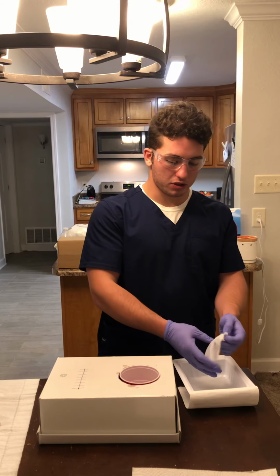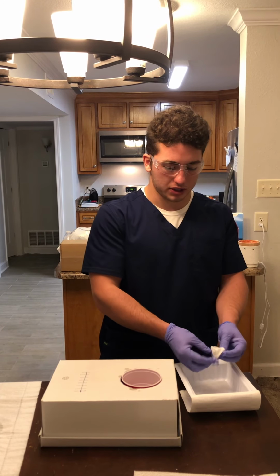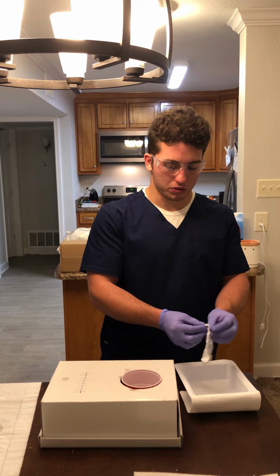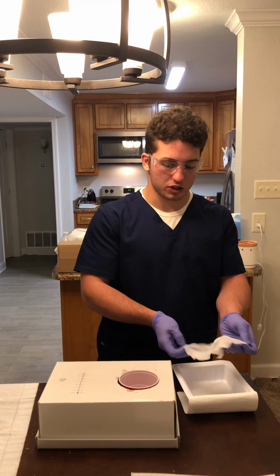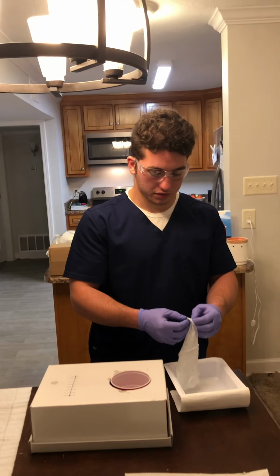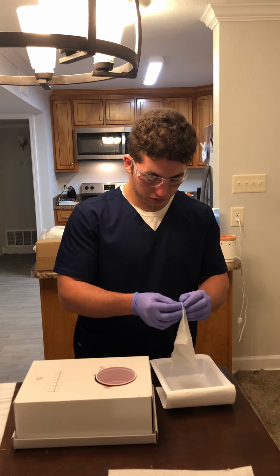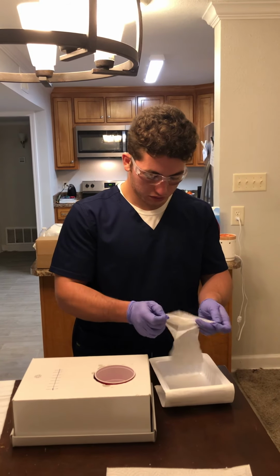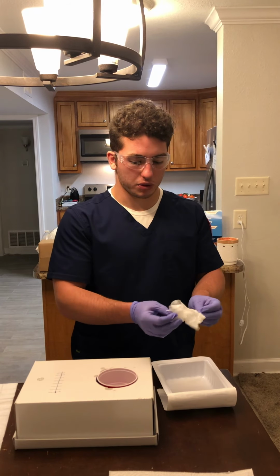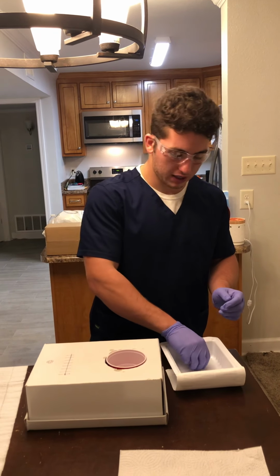I'm going to take a piece of the soaked gauze, wring it out, ensure not any splashes get on my sterile field. I'm now going to fluff the gauze to make sure it covers more space in the wound and the wound is not too tightly packed. When I place this in the wound, I'm going to ensure that I do not try to touch the outside of the wound with my hand.